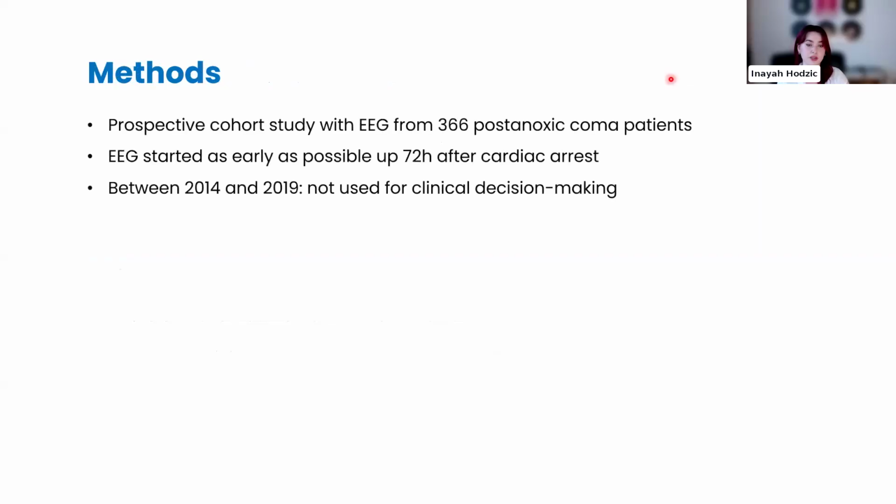So in order to do this, we performed a prospective cohort study with EEG from 366 postanoxic coma patients that were admitted to the Amsterdam UMC hospital between 2014 and 2022, I believe. So the EEG was started as early as possible and continued to record up to 72 hours after cardiac arrest.